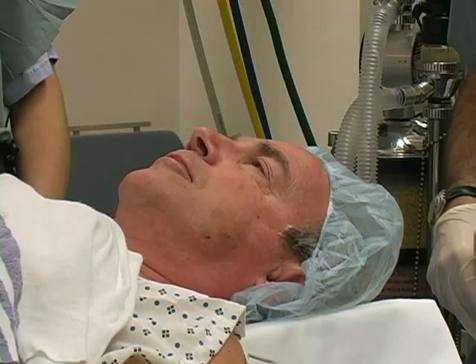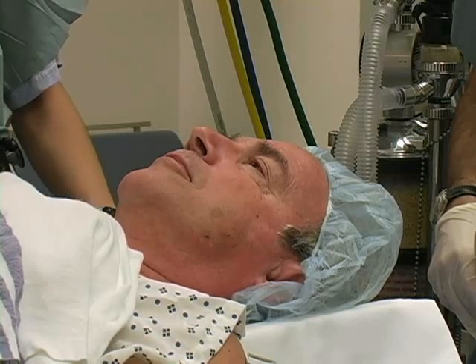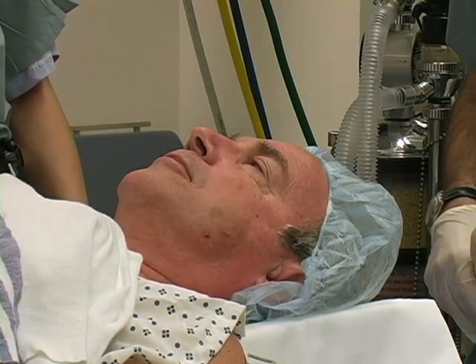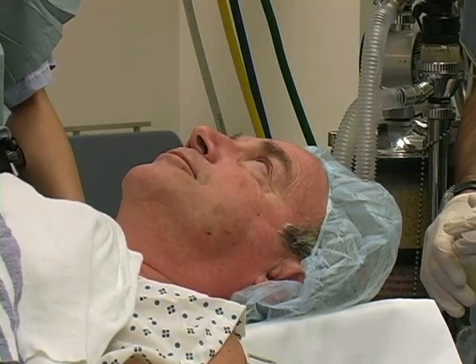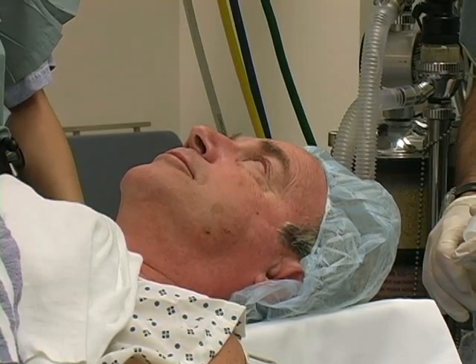Mask ventilation is a critical airway management skill in both controlled and emergent medical environments. The demonstration today will illustrate this skill in the operating room from the perspective of the anesthesiologist.